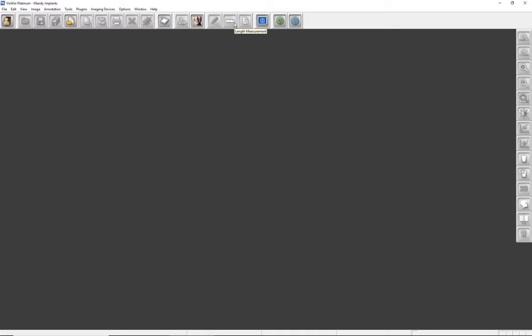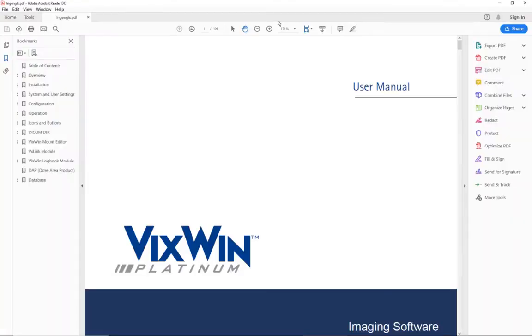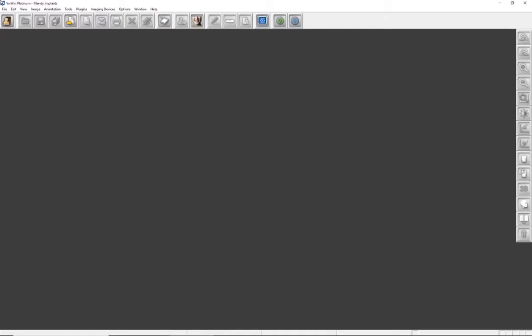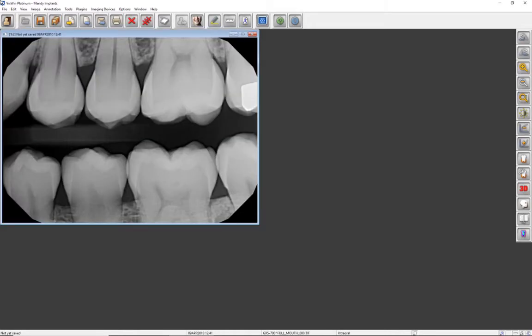Information regarding acquiring images into a mount can be found in the user manual, which is viewable by clicking on the user manual icon on the toolbar, or in the Capturing a Full Mouth Series video tutorial, which is available in the Imaging Solutions section of the CAVO.com website or on YouTube. Let's capture an image with our intraoral sensor.